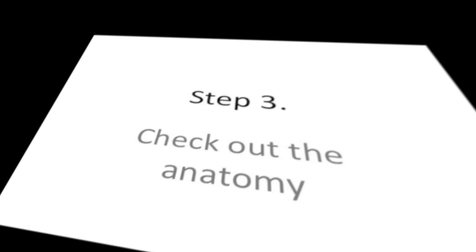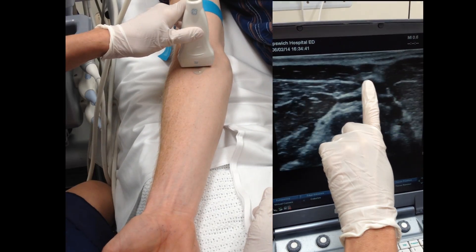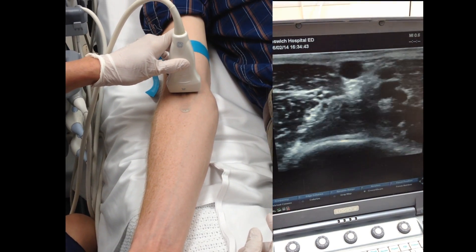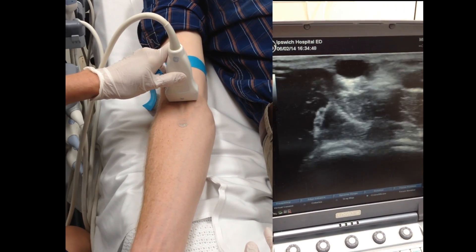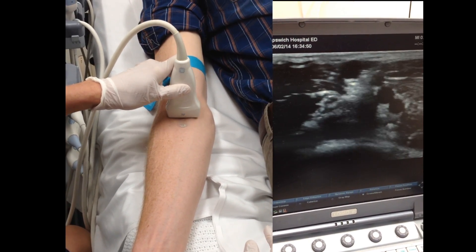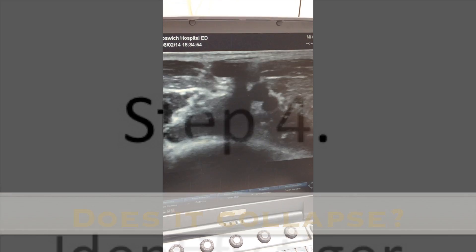Next, survey the territory. Slide the probe up and down the arm, watching the direction of the vein, whether it bifurcates, whether it dives. It's also important to compress the vein to check that it is patent and is in fact a vein.